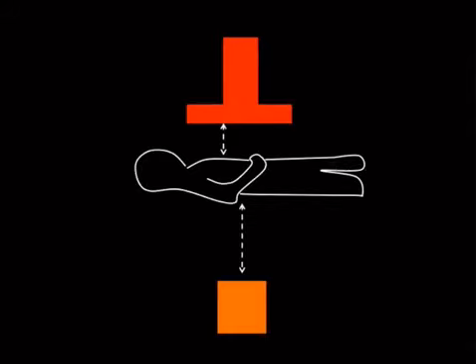Now let's talk about some things that you can do to reduce the dose. So just to orient you here, this is our source, the orange one, and this is our patient or object source distance. And then this is our II, so this is our object to receptor distance here.